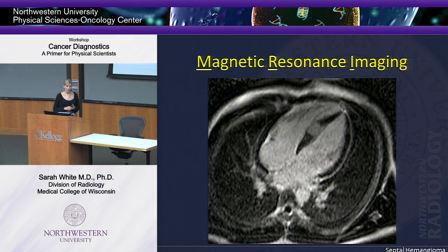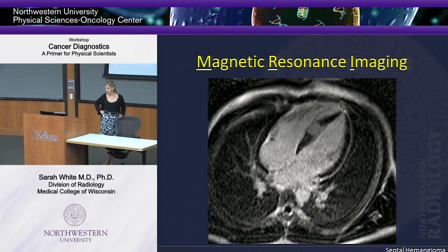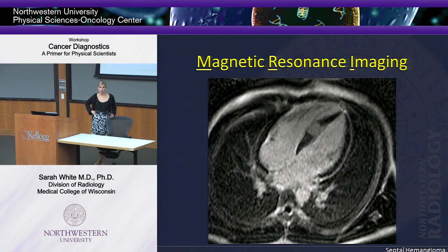And then we get to MRI. MRI also came through the pipeline, I think, in the 70s, and this has just changed the way that we practice medicine. MRI is basically we put patients in a magnet, and then we change the magnetic field, and the atoms in different tissues respond to magnets differently. And then that gives them a signal, and we can read that signal.